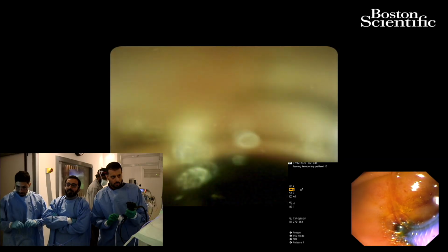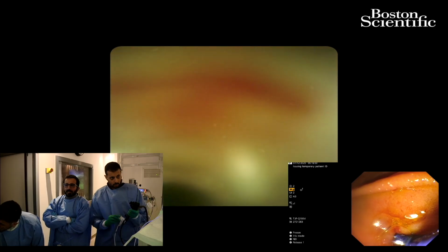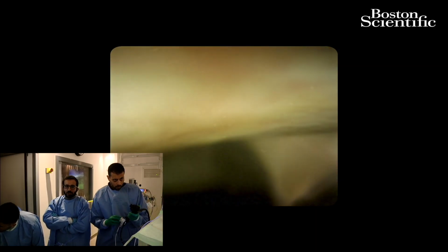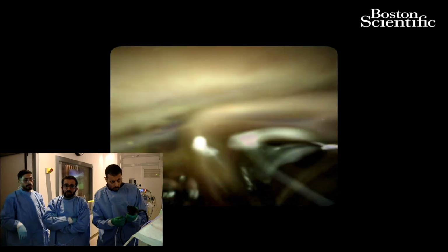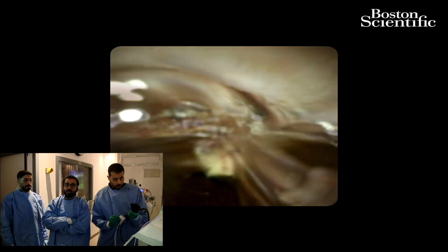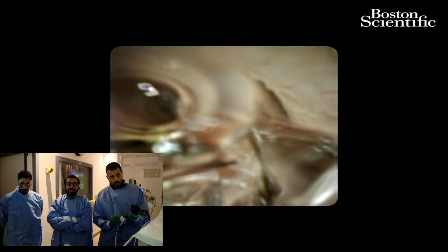Still some of it could be taken out with the CRE balloon. However, the patient has a peri-ampullary diverticulum. So going with the cholangioscope, and since the size is 2 centimeters, I think will be the best option. And the stone is completely obstructing the CHD because we could not advance the balloon beside the stone.